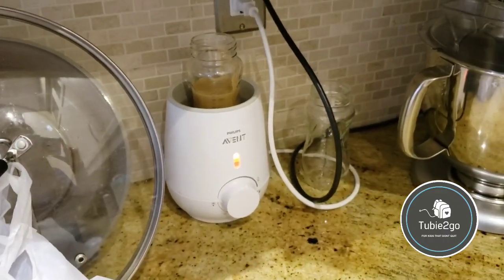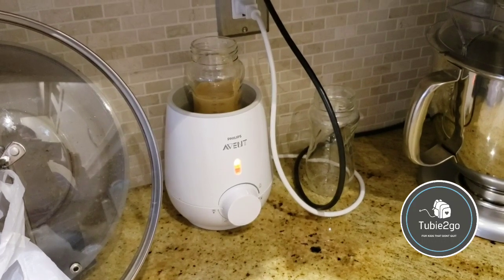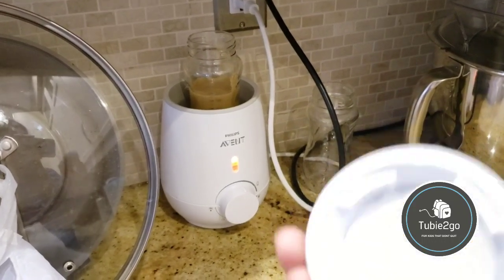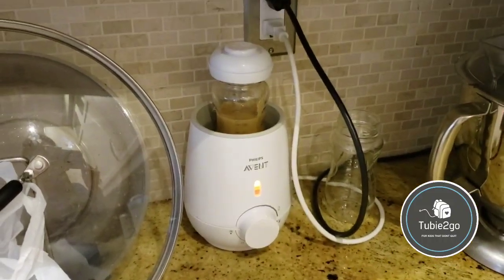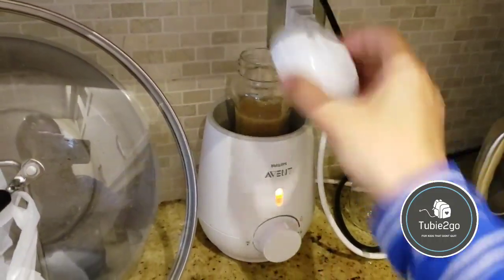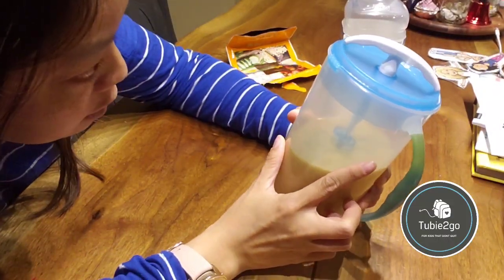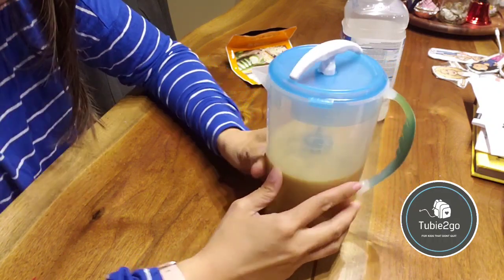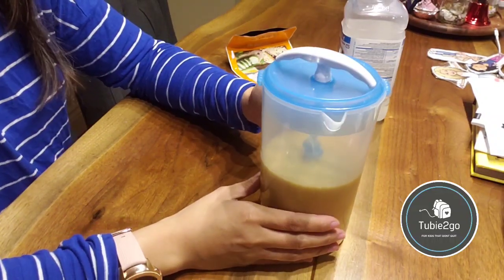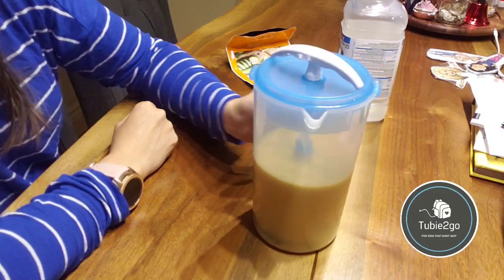We like to warm Magnus's feeds beforehand — other folks like to serve it cold. I've got these flat caps so that we can store them in the fridge without taking up as much room. It is a 40-ounce pitcher — 1200 mils — so it's a pretty reasonable size depending on how many ounces your kid takes per feed.